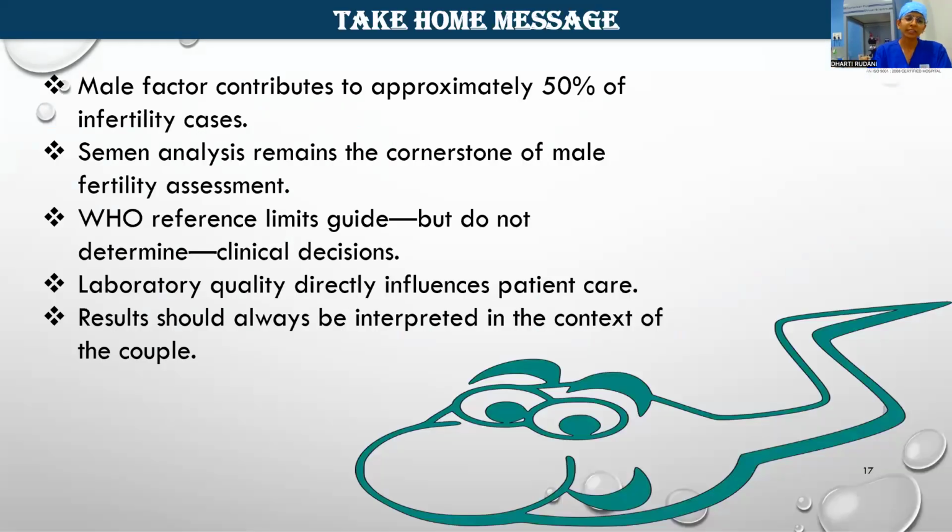Male factors contribute to approximately half of all infertility cases, making semen analysis an essential part of infertility evaluation. Accurate interpretation, standardized laboratory practice, and appropriate clinical correlation are the key to selecting the right treatment and achieving the best possible reproductive outcome. Thank you for your time. I would be happy to answer any questions.